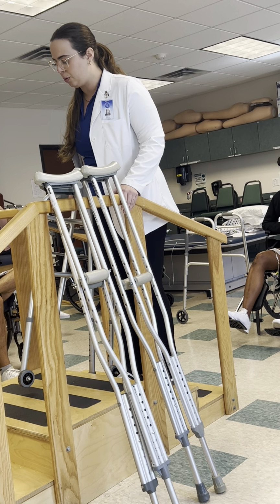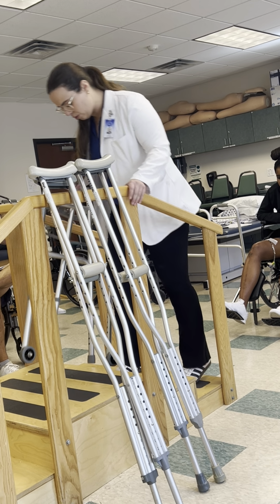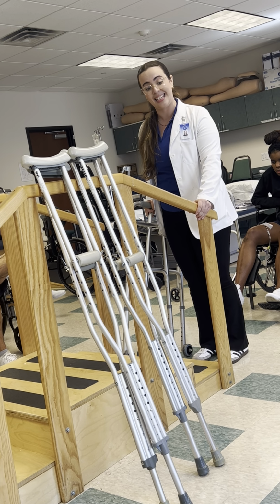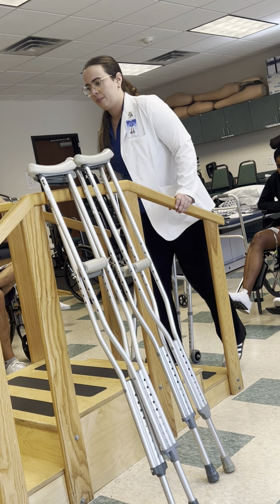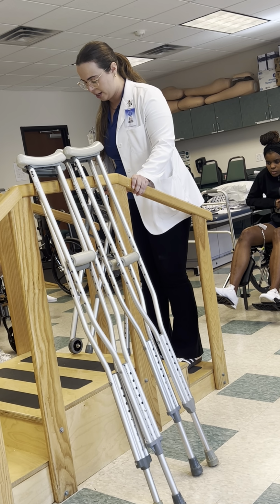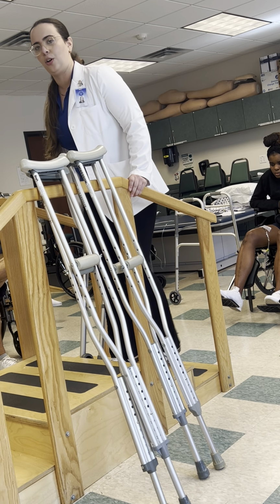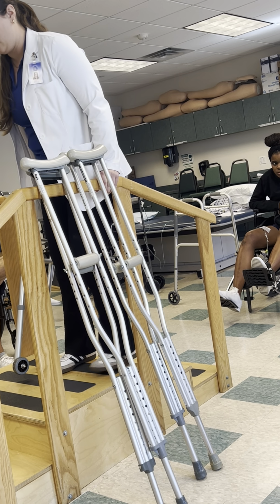Okay, so we're here with the rolling walker. Remember, we go up with the good, down with the bad. Okay? So I'm going to go again. Up with the good, down with the bad. Assistive device, up with the good, which in Claudia's case is her right side. Okay? And then her involved side, which is her left side. Assistive device, making sure it's secure. Up with the good, right side, then left.